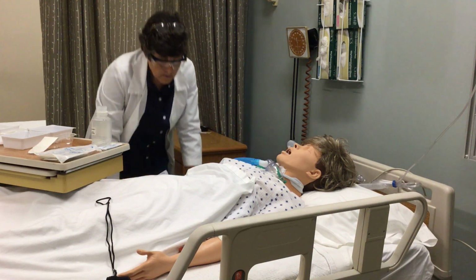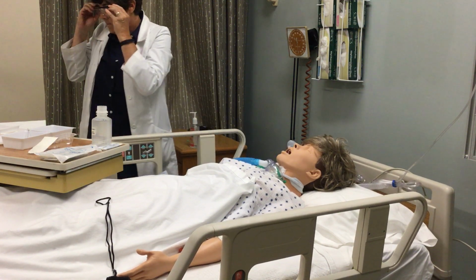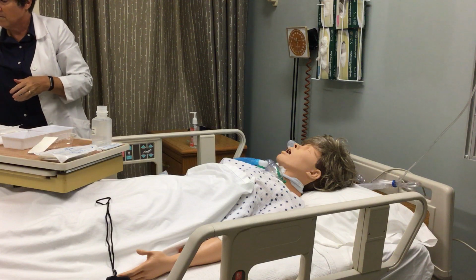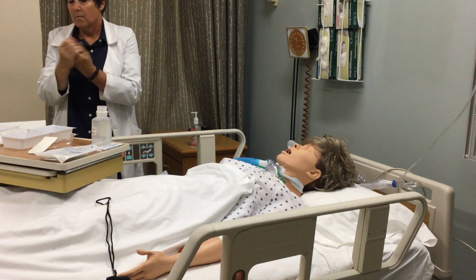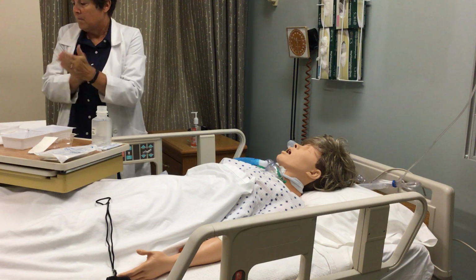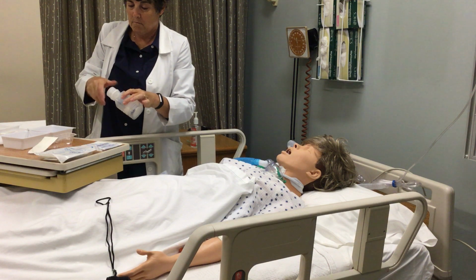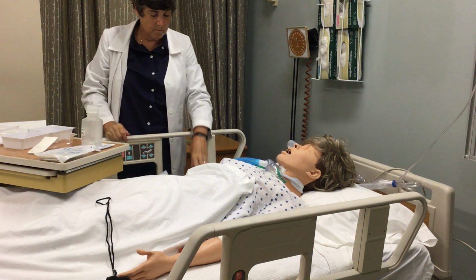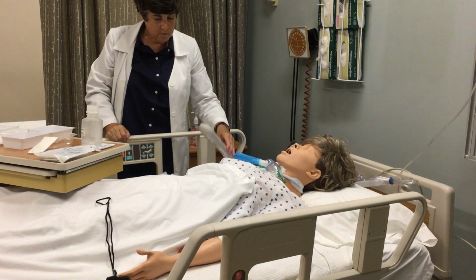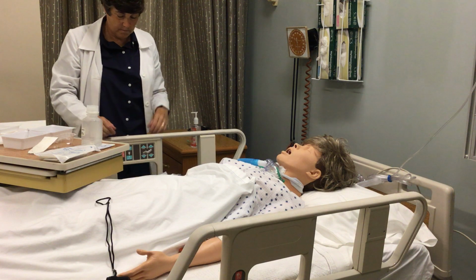Remove gloves and face shield and discard them in the appropriate receptacles. Replace cap on the bottle of normal saline. Date the container and store this and other reusable liquids in an appropriate area. Help the patient into a comfortable position. Place the call button and other items within easy reach. Ms. Cruiser, here's your call light. Are you comfortable at this position? Yes, I am.